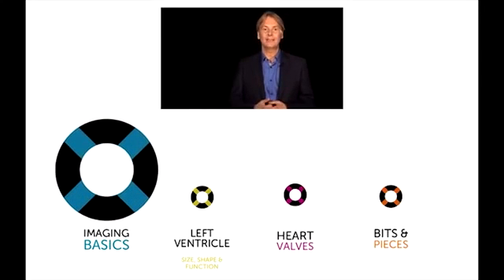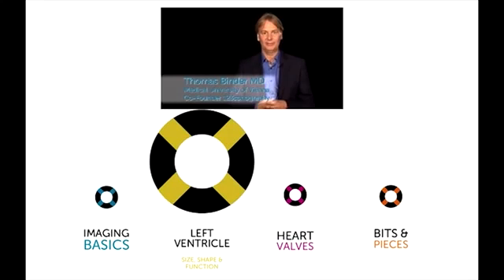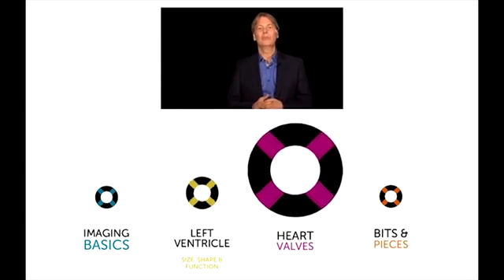In part 1, we dealt with the basics of echocardiography. In part 2, with left ventricular function. In part 3, with valvular heart disease.